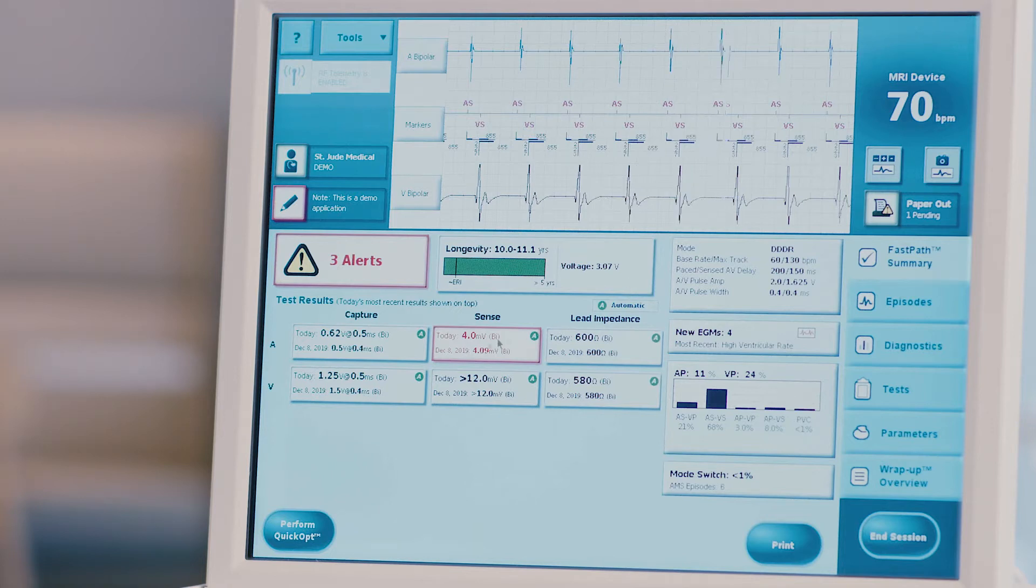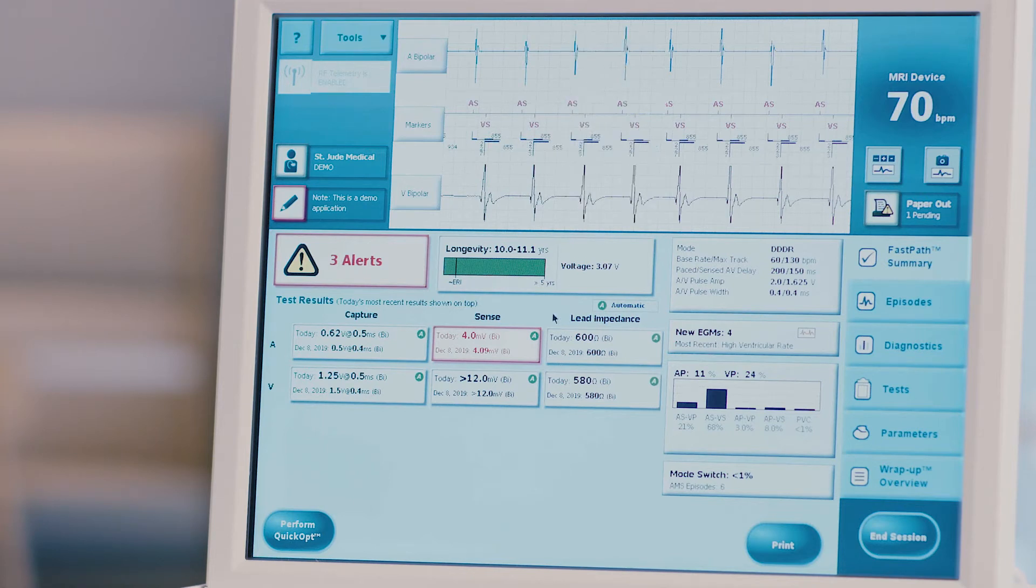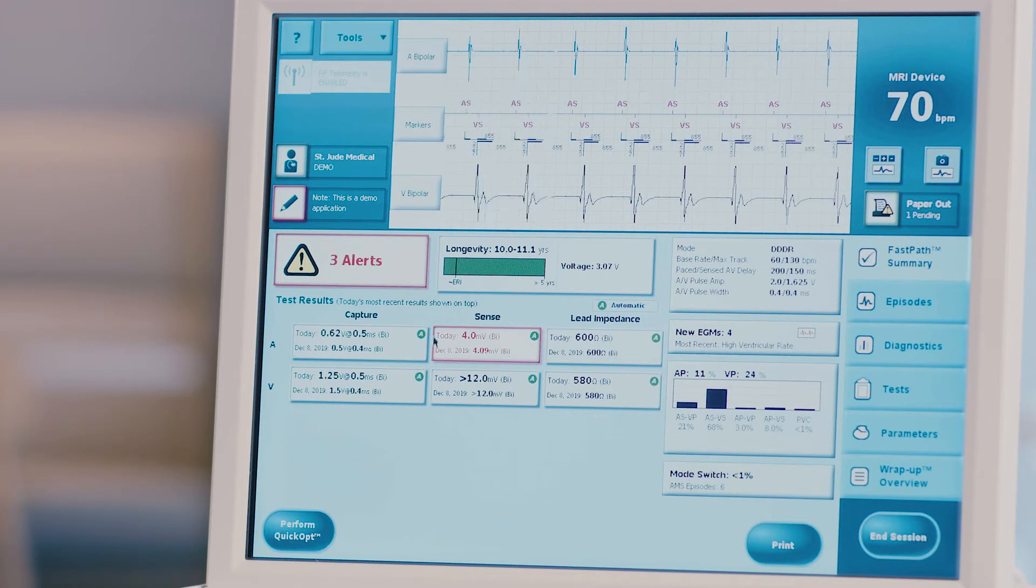Evaluate the automatic test results, denoted by the presence of a green A in the measurement box, measured by the device upon interrogation. Note that any box outlined in red either does not meet the safety margin or is outside the acceptable measurement range.